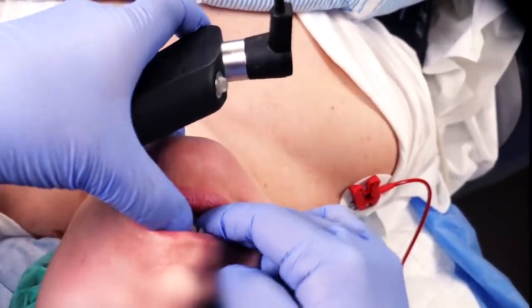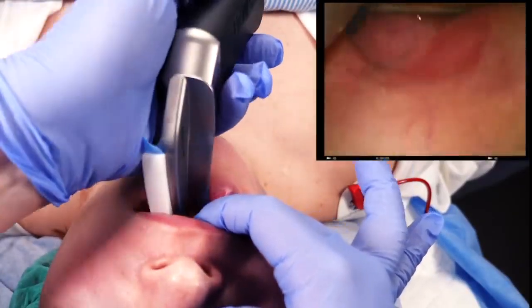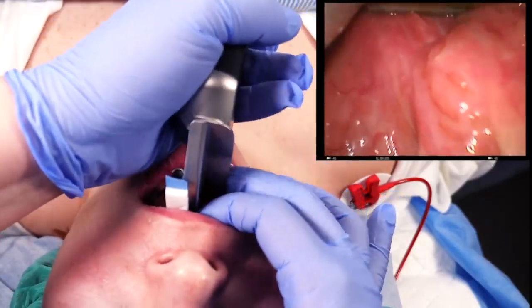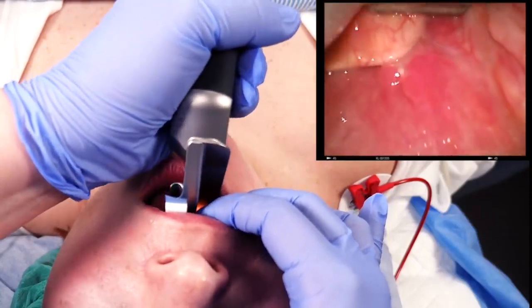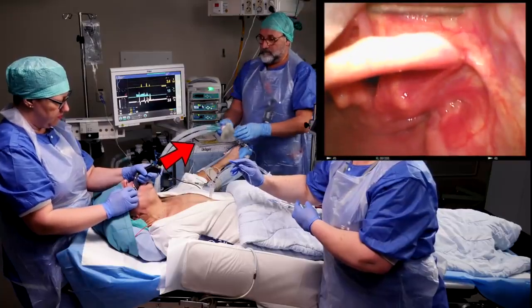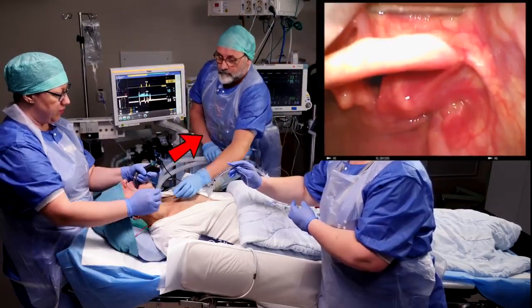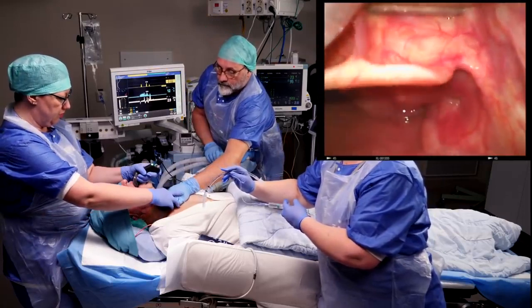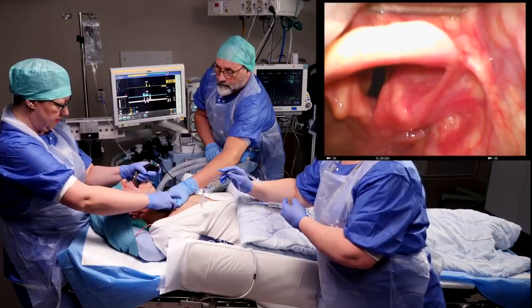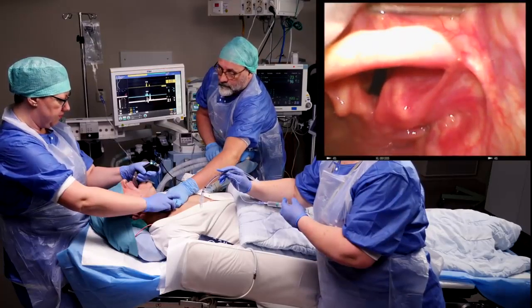Advance the blade until you see the epiglottis and place the tip in the vallecula — the recess at the base of the tongue. At this point you can start to apply some force in the direction of the laryngoscope shaft. Sometimes a light external force on the larynx can make the vocal cords spring into view. Ask for your assistant's hand and move it to apply backwards-upwards-rightward pressure, or BURP for short.